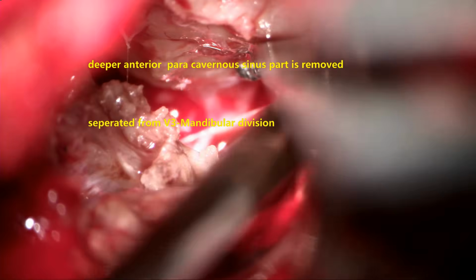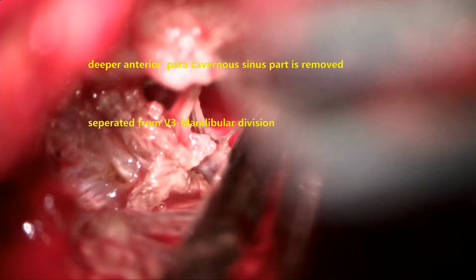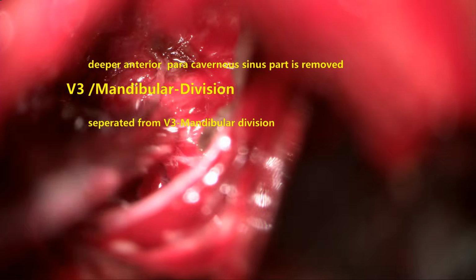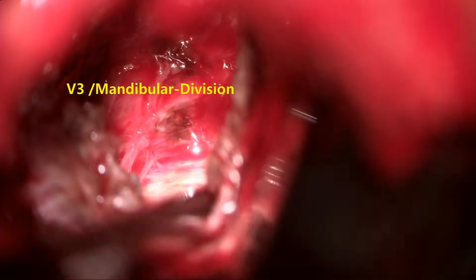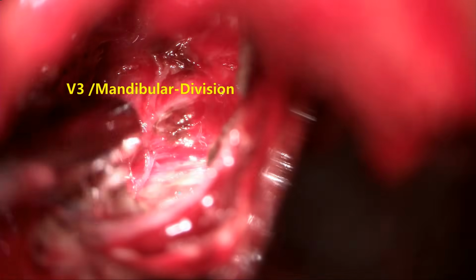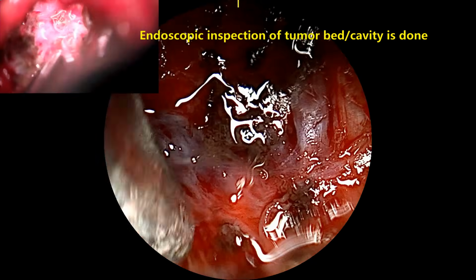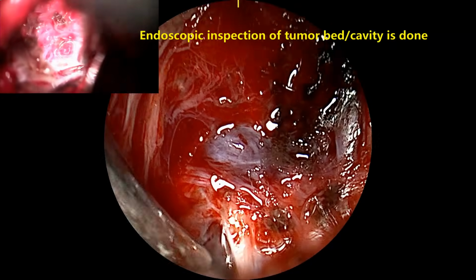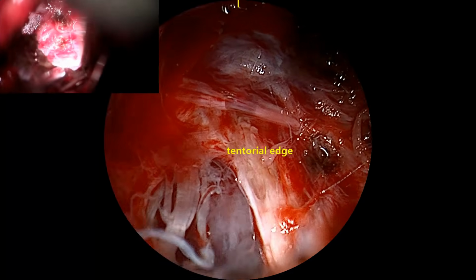Now you can see the tumor we are separating from the third division, the mandibular division, laterally and inferiorly, and separating from there is an arachnoidal plane which can be separated. That's the mandibular division entering into the foramen ovale, and that is showing the mandibular division of the trigeminal ganglion. Again, we bring in the endoscope and visualize the structures. Now you can see the tumor appears to be taken out in the deeper medial superior part where we can't see with the microscope.